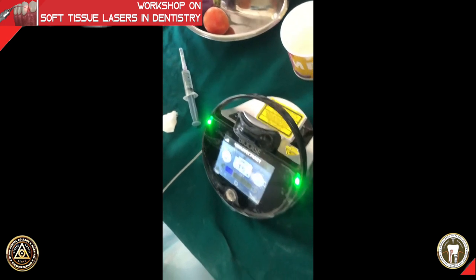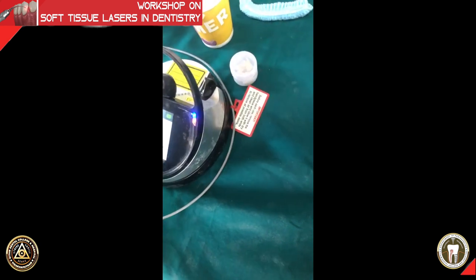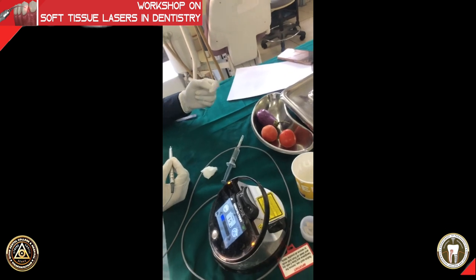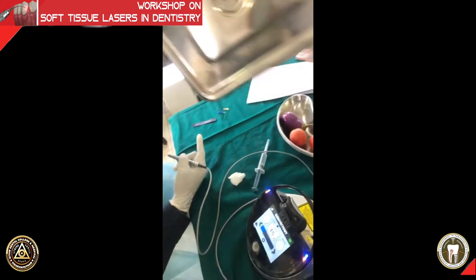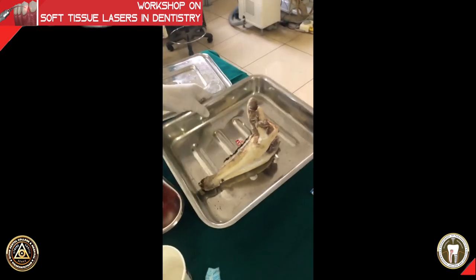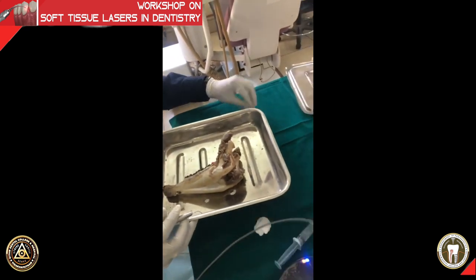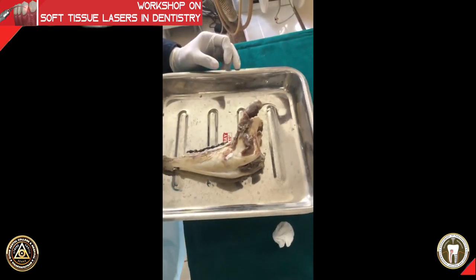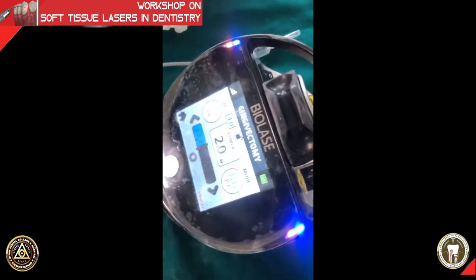We will now move on to the goat mandible. There is one thin strip of tissue around the tooth where we are going to demonstrate two things. First, we will show a gingivectomy as you would do for crown lengthening clinically. We are again using pulse mode with a higher power setting of two watts.